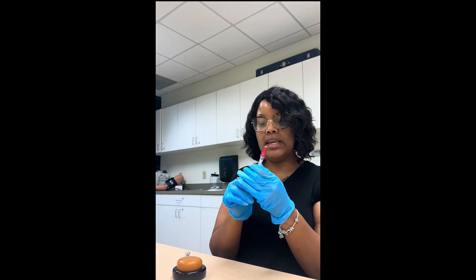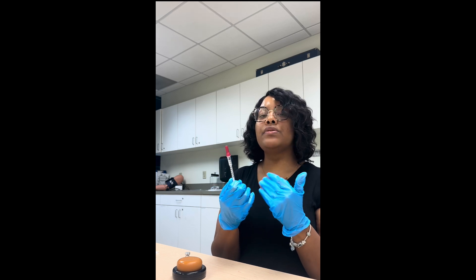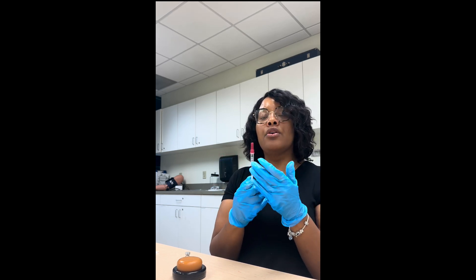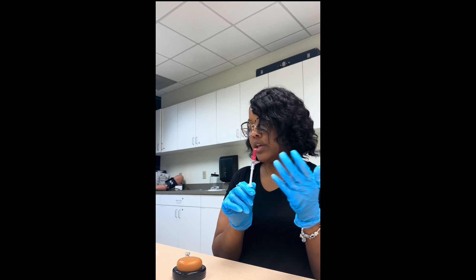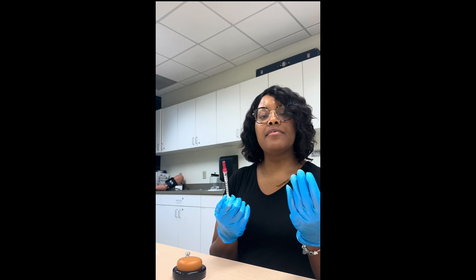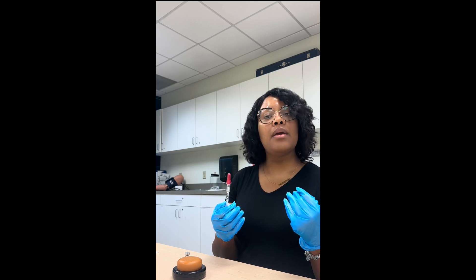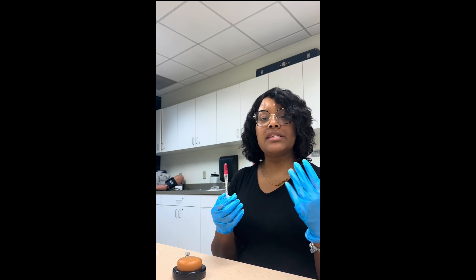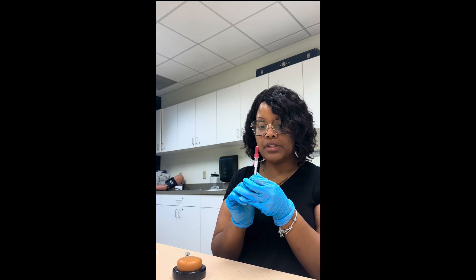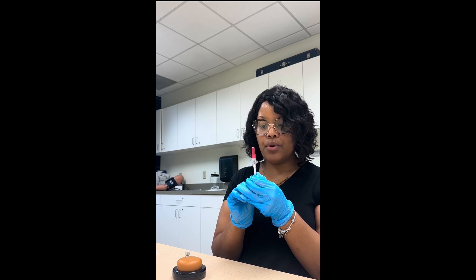With this syringe, it's important to use a TB syringe or a smaller unit ml syringe, since we're only going to 0.1 ml. If we had grabbed a 10 ml syringe, there would have been no way we'd be able to see that amount. We're going to draw up to 0.1 ml, which is easy to see on this syringe — it only holds one ml.